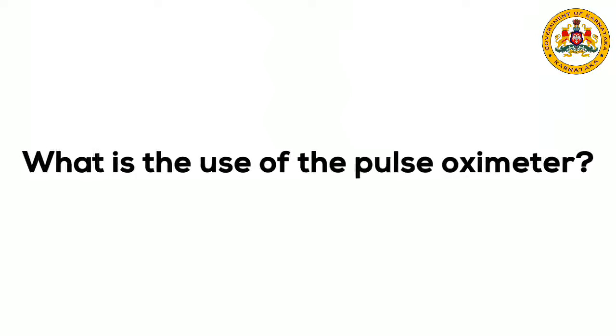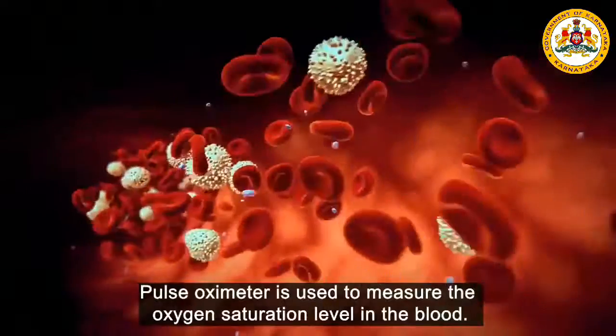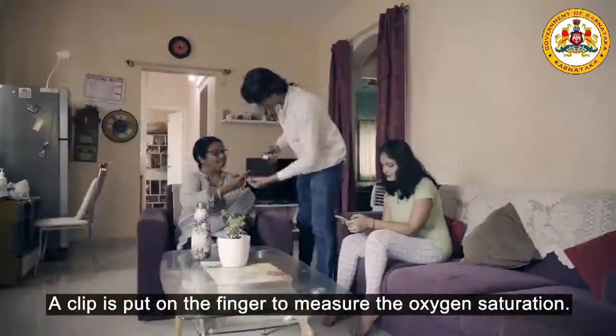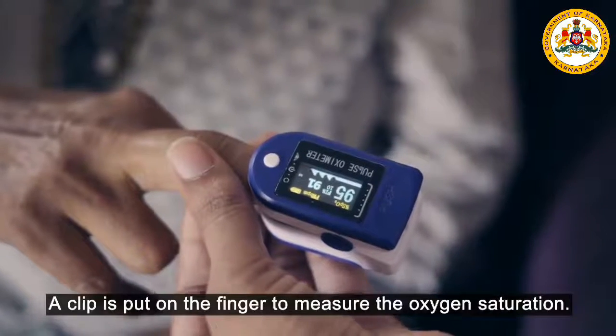What is the use of the pulse oximeter? A pulse oximeter is used to measure the oxygen saturation level in the blood. A clip is put on the finger to measure the oxygen saturation.